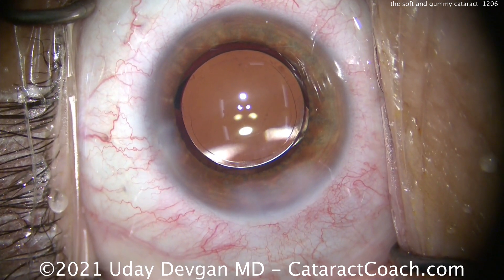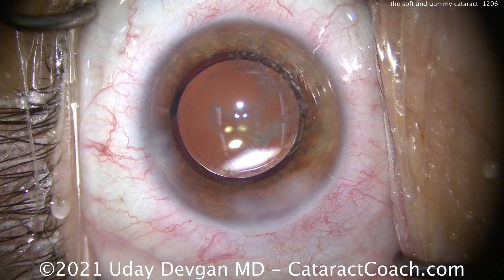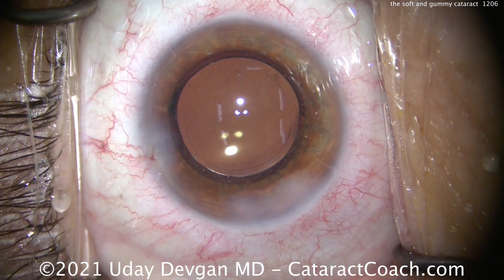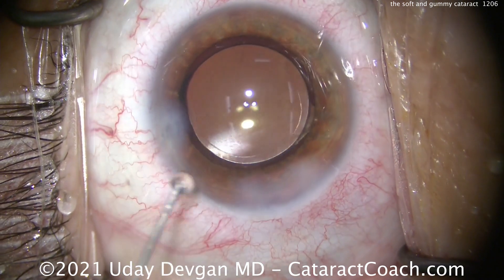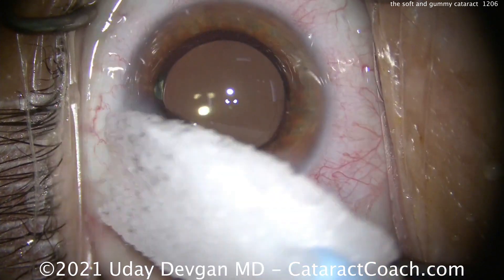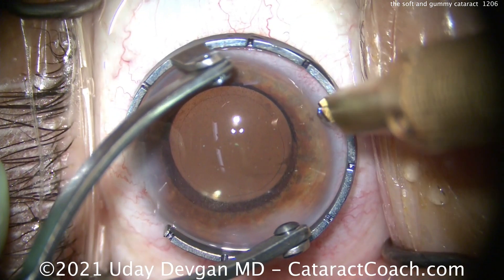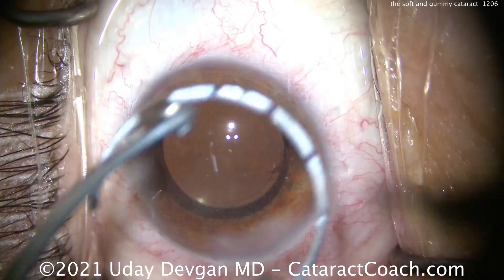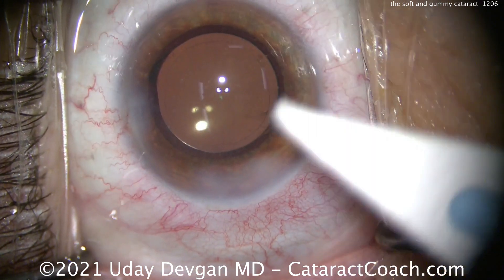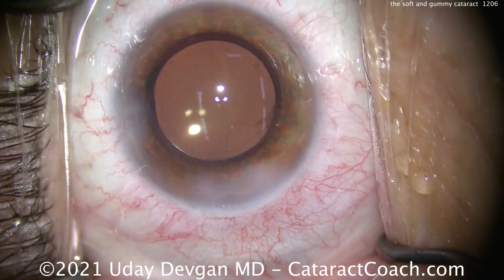Even if the chop doesn't propagate — and you saw in my video that it did not propagate — you're still trying your best with the chopper to split it. If not, use the chopper to gently bring the nuclear pieces out of the capsular bag up to the iris plane. I put some Tri-Moxi inside the eye, along with some preservative-free moxifloxacin. That overlap of the optic by the capsulorhexis looks great — the rhexis is more like 5.5 millimeters and beautifully centered. We'll treat a small degree of astigmatism with a limbal relaxing incision, and the patient ended up with basically perfect plano refraction and 20/20 vision. Next time you have a patient with a gummy cataract, you'll recall exactly what to do.